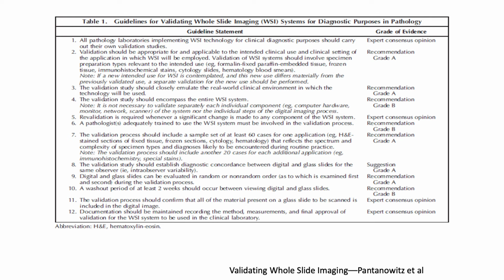The validation study should establish diagnostic concordance between digital and glass slides for the same observer. A washout period of at least 2 weeks should occur between viewing digital and glass slides. The validation process should confirm that all of the material present on a glass slide to be scanned is included in the digital image.